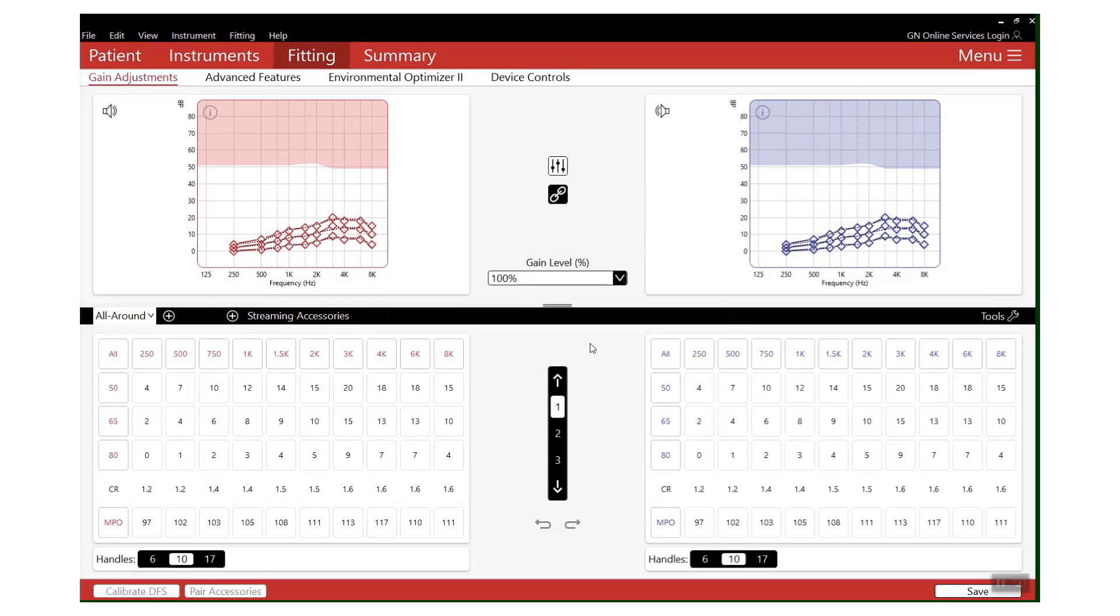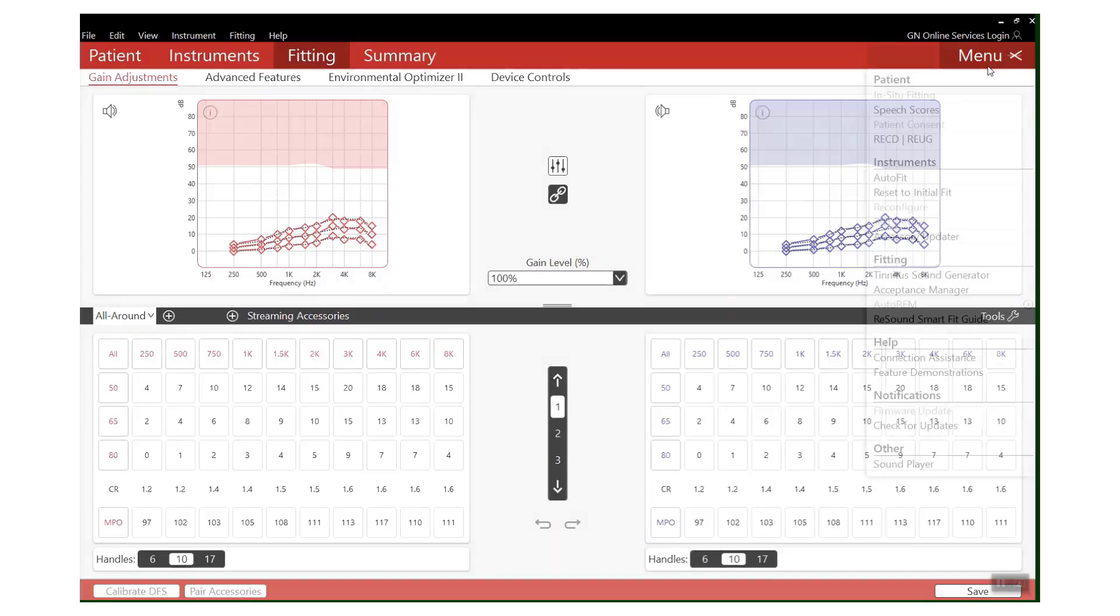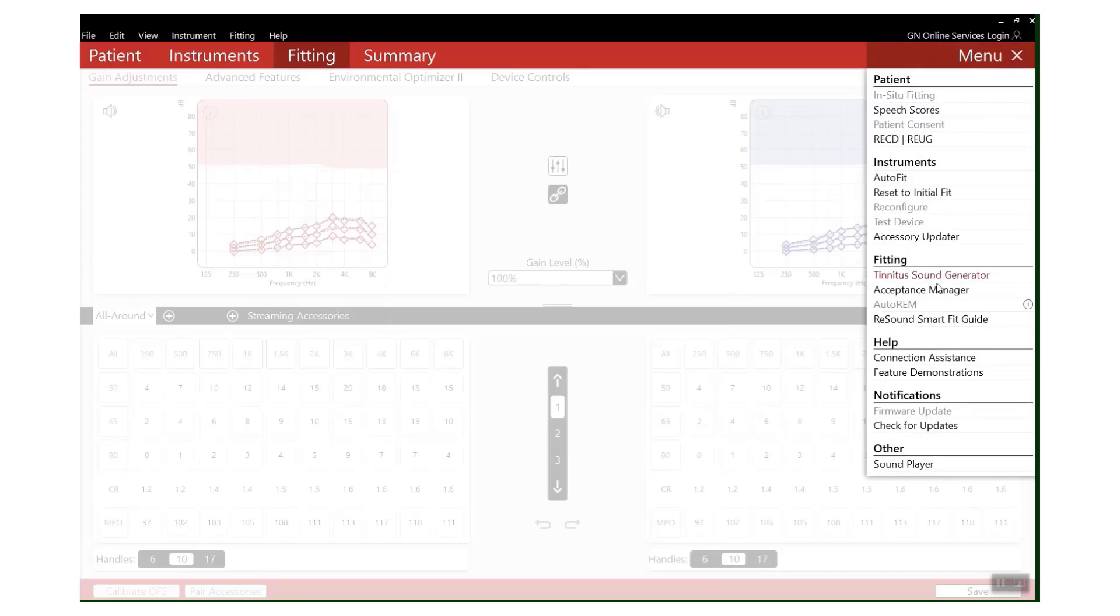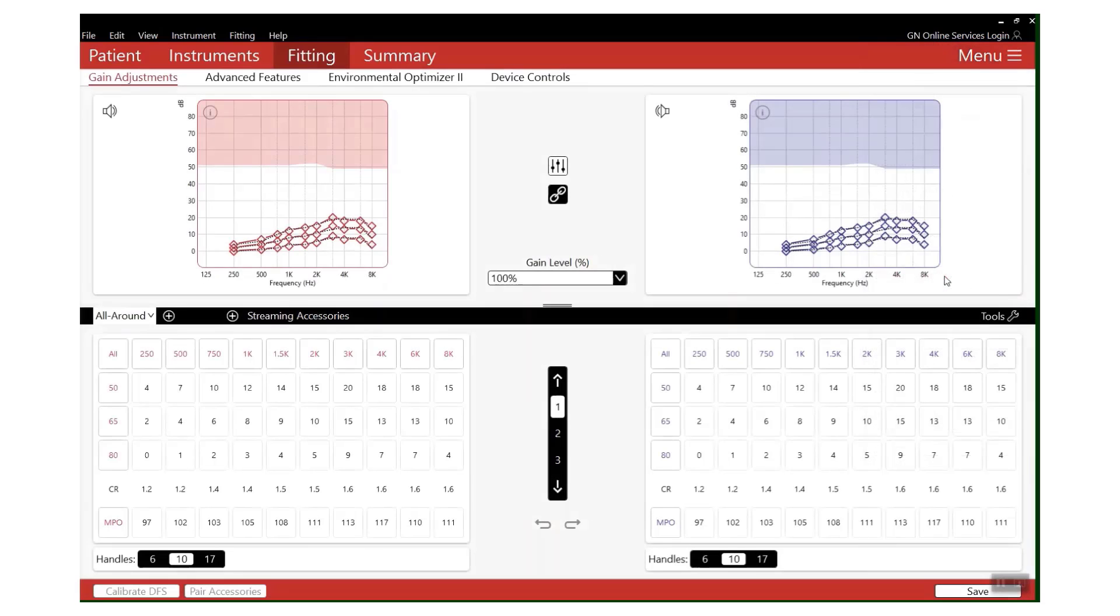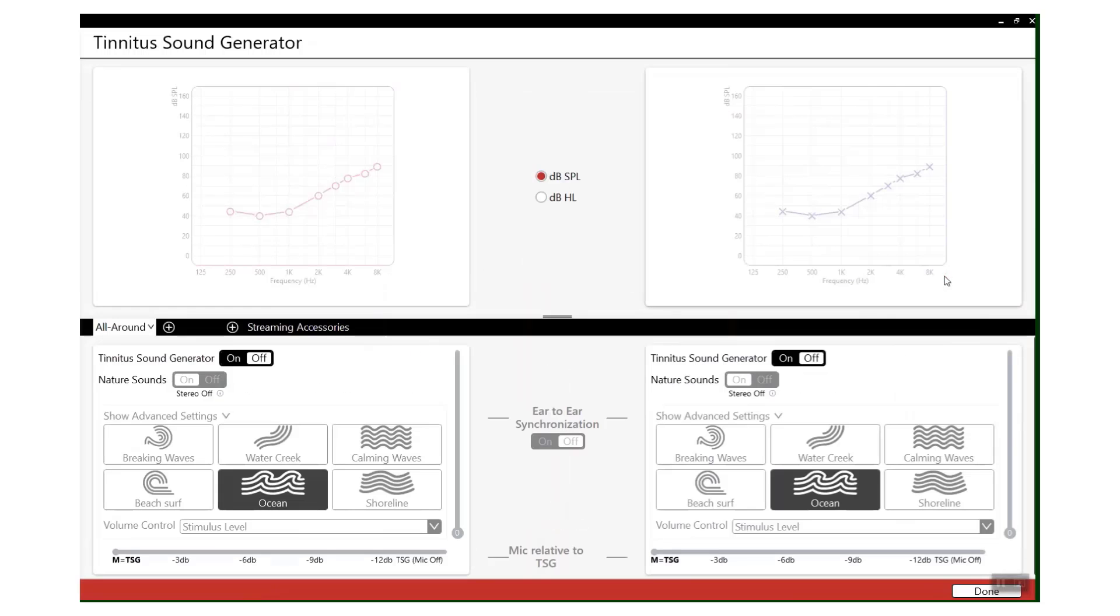Finally, tip six: tinnitus relief. We currently have two helpful tools that can help those suffering with tinnitus. The first thing we have, which is within the software, is our Tinnitus Sound Generator. You'll find it in Menu and then down under Fitting.